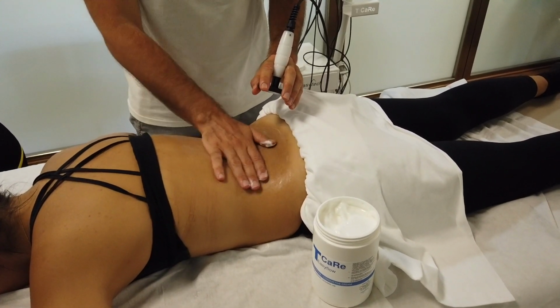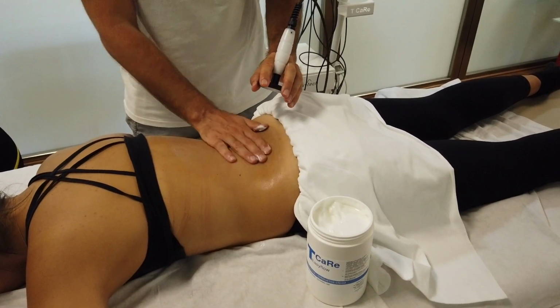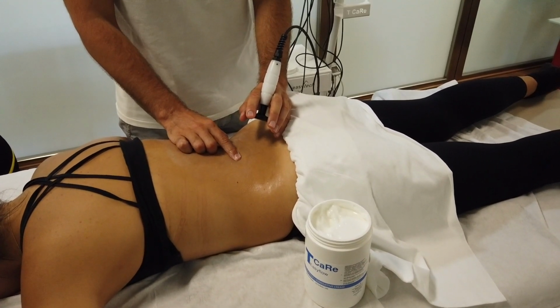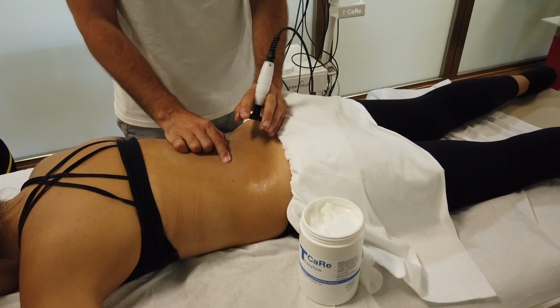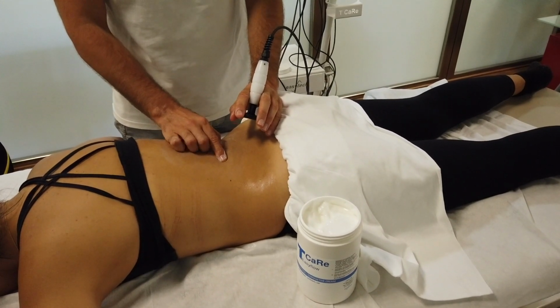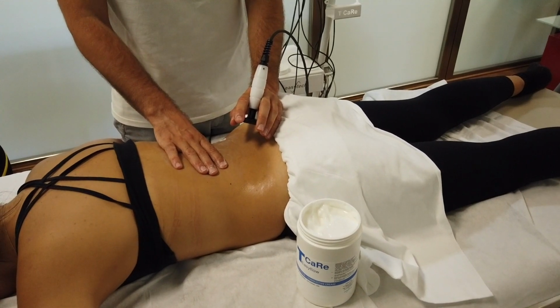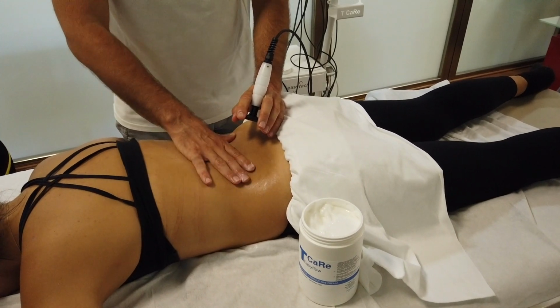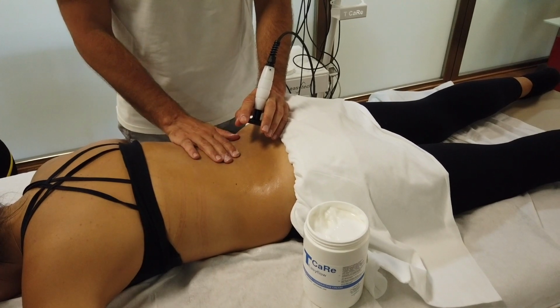The frequency of the sessions is 2-3 sessions per week on alternate days. Duration of the session is 20 minutes, half the treatment capacitive and half with a resistive electrode. I set the frequencies from 420 to 500 kHz. Emission mode continuous. So now I set the equipment and I start the treatment.